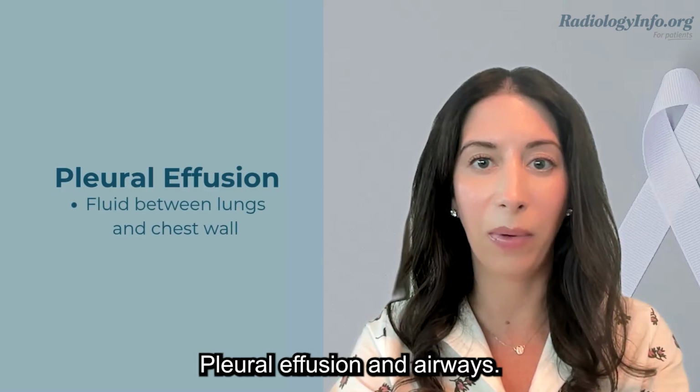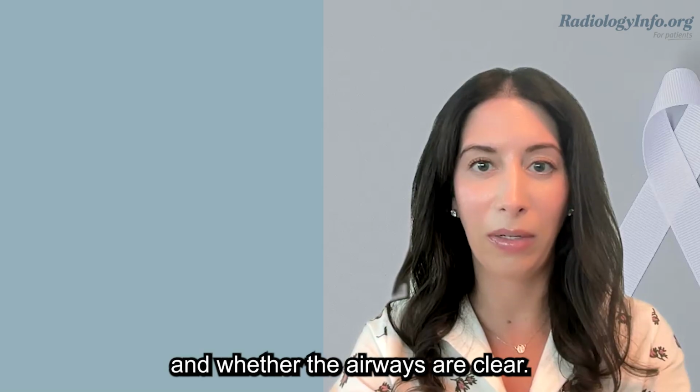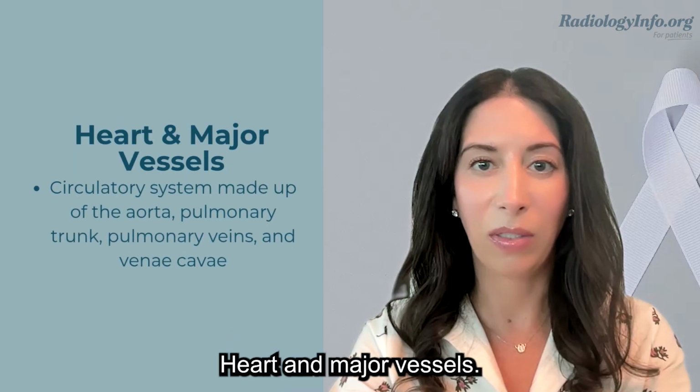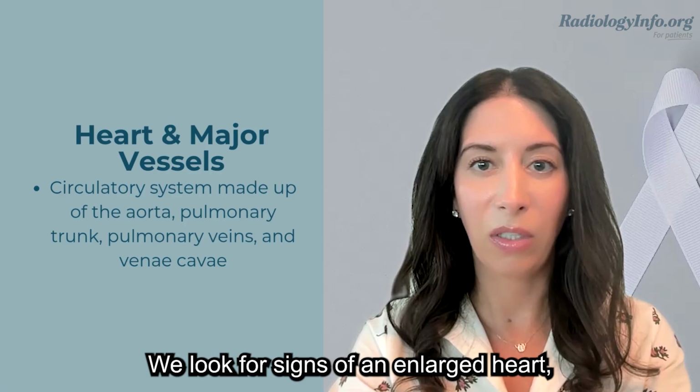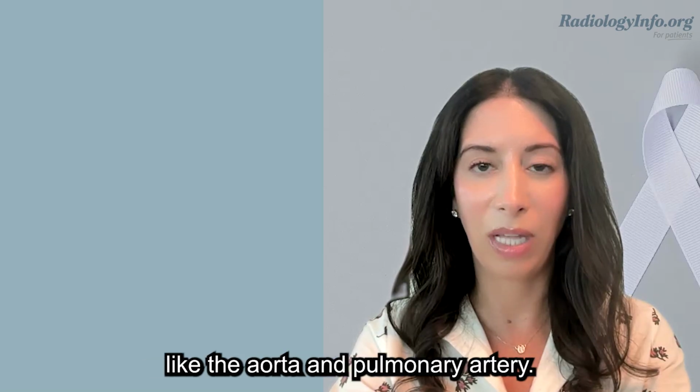Pleural effusion and airways. We check for fluid around the lungs and whether the airways are clear. Heart and major vessels. We look for signs of an enlarged heart, fluid around the heart, or abnormalities of major blood vessels like the aorta and pulmonary artery.